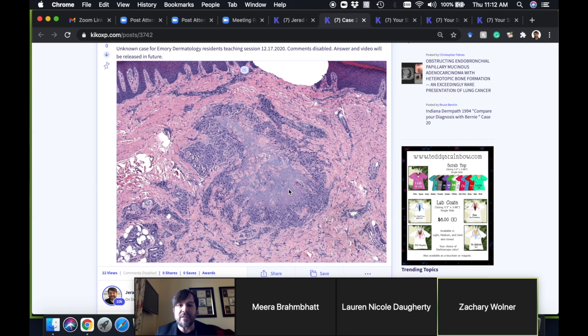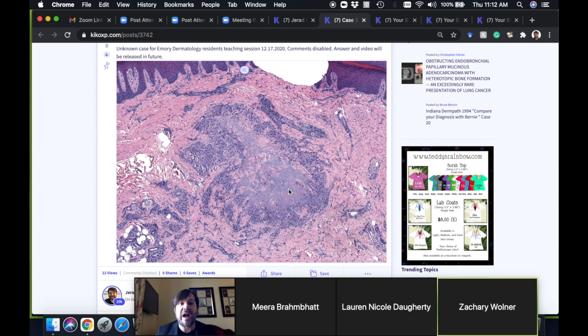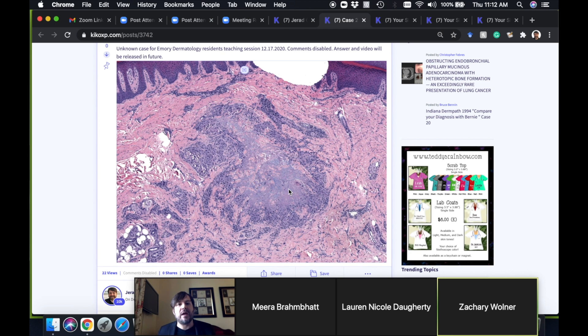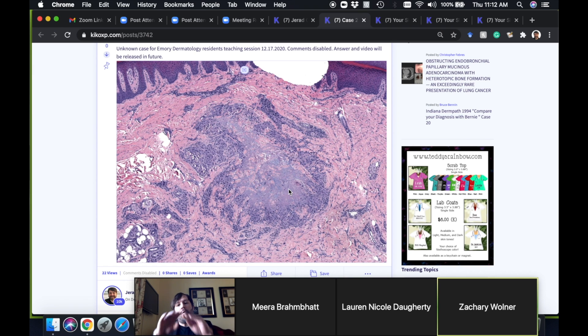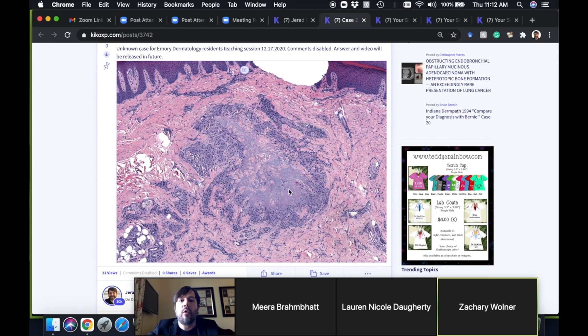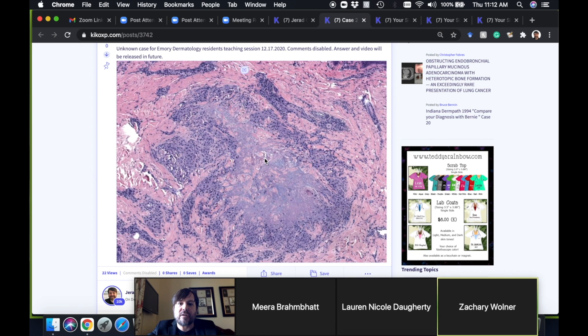They really run a wide range. They can go from being very subtle interstitial pattern where they trickle between collagen, all the way up to ones that are very well-formed palisades around a beautiful mucin-rich core of necrobiosis.